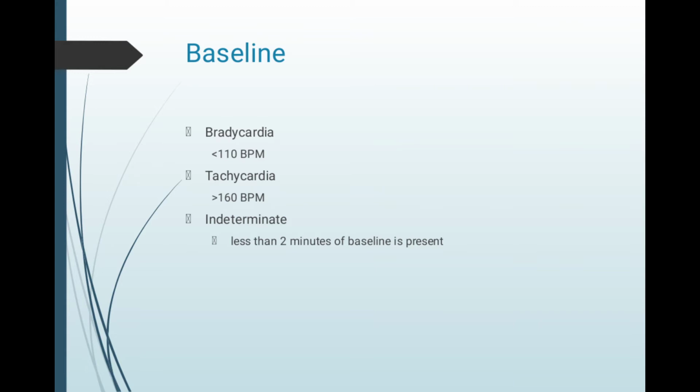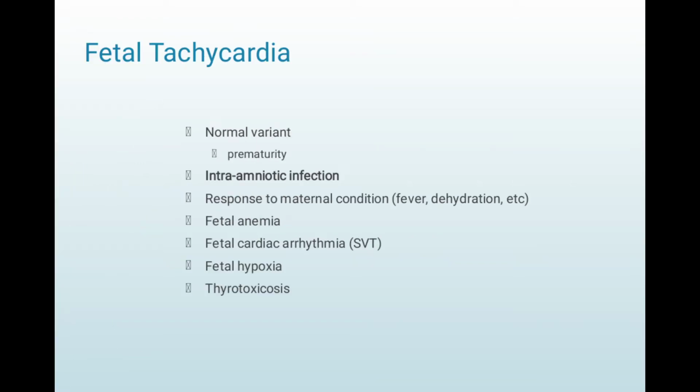Bradycardia is below 110 beats per minute, tachycardia is above 160 beats per minute, and it is indeterminate if less than 2 minutes of baseline is present.